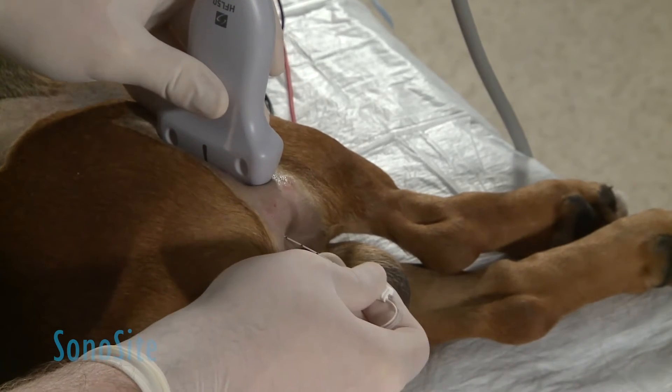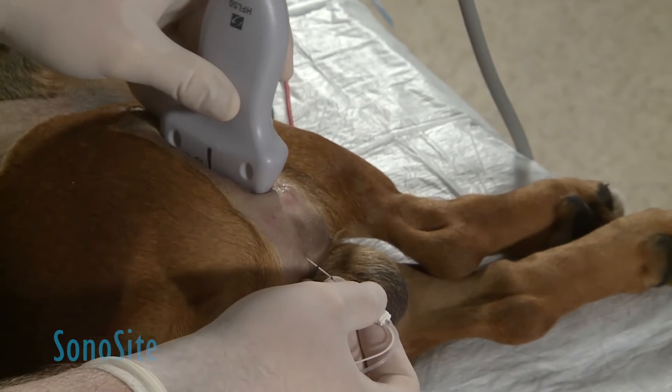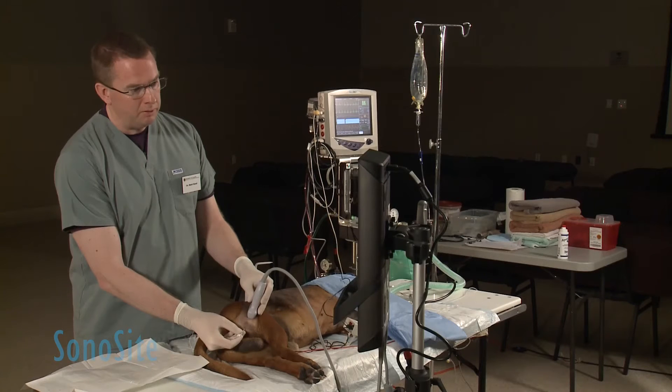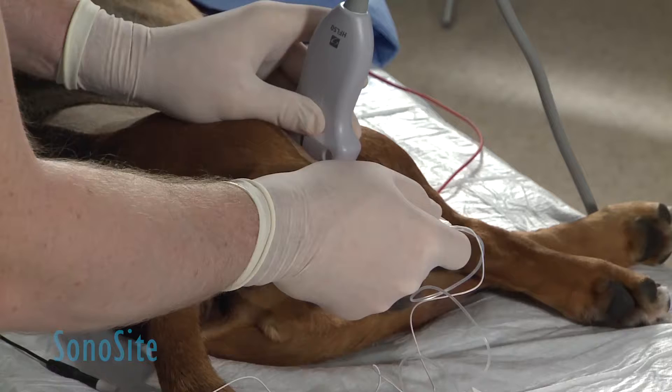These are nice blunt needles, which means they're a little bit tricky to get through the skin. But once you're through the skin, the more blunt bevel and needle tip allow you to actually appreciate different tissues as you penetrate.